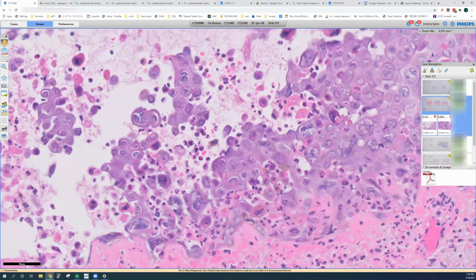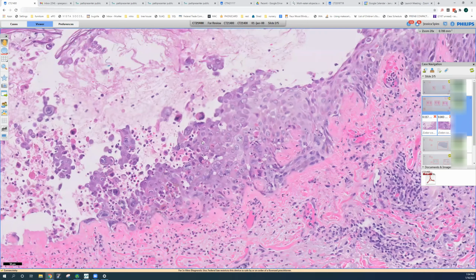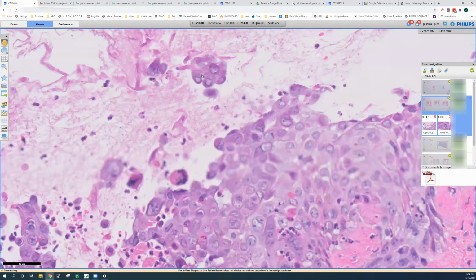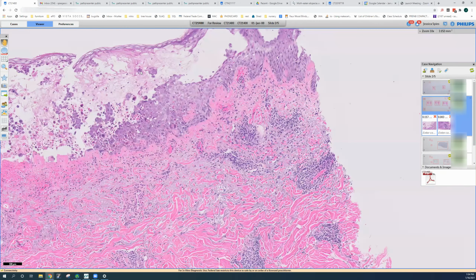Sometimes multinucleate here. So this is a beautiful example of a herpetic dermatitis, more smudgy gray nuclei. Actually, what this phenomenon is, the chromatin is being marginated to the edge of the nucleus. Here's another multinucleate cell with that smudgy gray appearance.